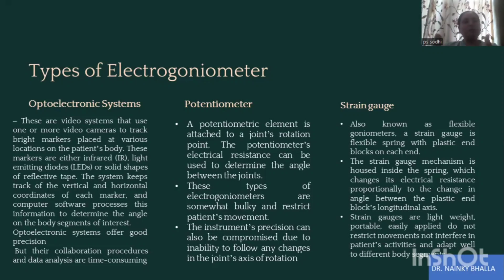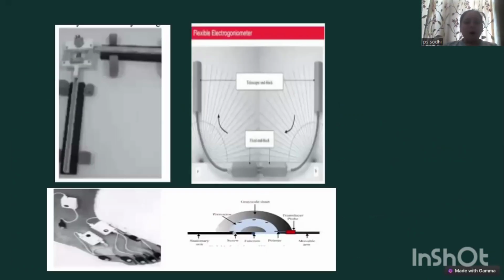But potentiometers we used till the 21st century, that is, in 2000 we used to use potentiometers. But now we have moved towards the flexible goniometer, which has digital displays along with markers. Fine. So I wanted to show you this. This is a flexible goniometer.